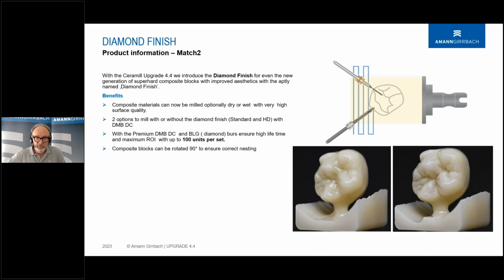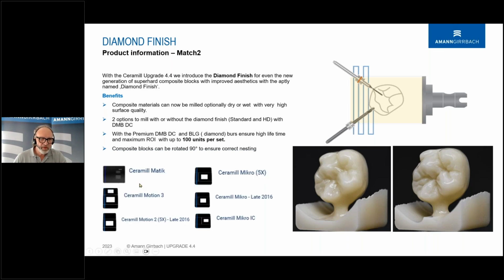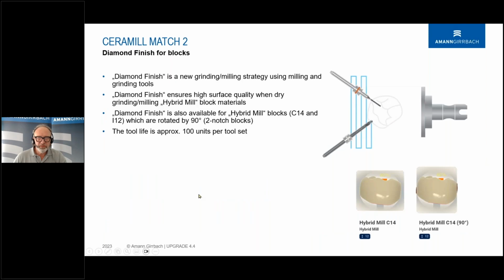Ambarino, also a multi-layer with a really nice aesthetic. I think Ambarino is also very famous in Italy. So try this new workflow, the diamond polishing, with these highly interesting materials, the multi-layers here. Developed for all our milling machines.